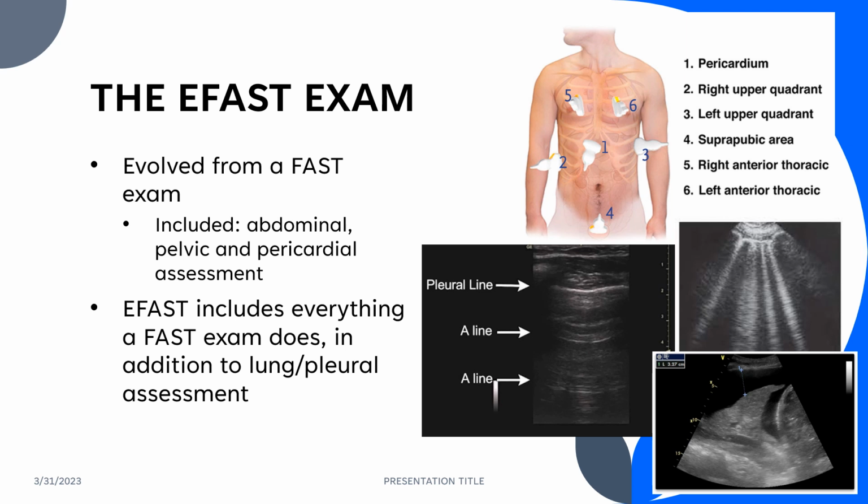Usually the larger the equipment is, the better the resolution is going to be, and the easier it is going to be to see these things. So you want to make sure that if you are investing in the equipment, you're getting something that at least you feel confident relying on.